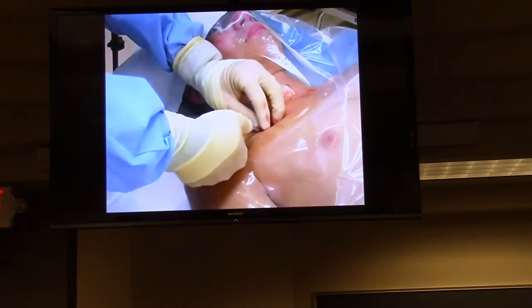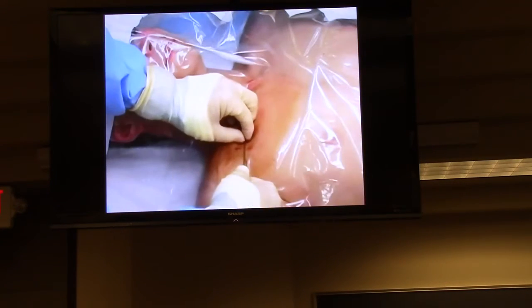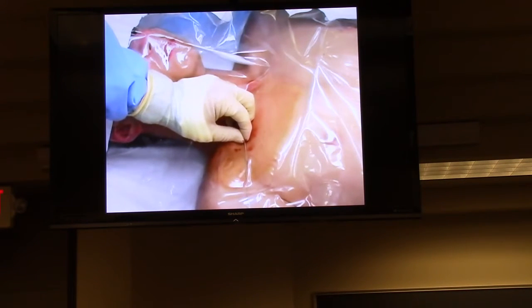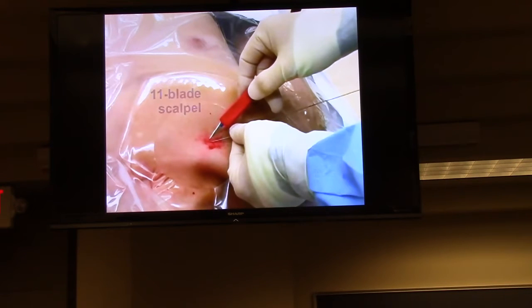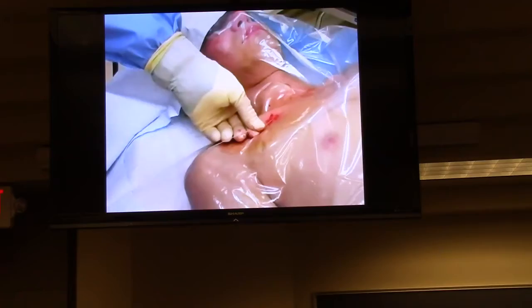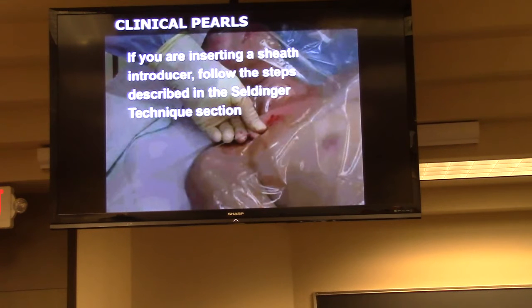Once the wire has been advanced, first remove the guide wire housing and then the needle, leaving the guide wire in the vessel. Be careful to always maintain a firm grip on the wire. Next, use the 11-blade scalpel to enlarge the puncture site, making sure you do not cut the guide wire in the process. In this video, we demonstrate the insertion of a triple lumen catheter. If you are inserting a sheath introducer, follow the steps described in the Seldinger technique section.